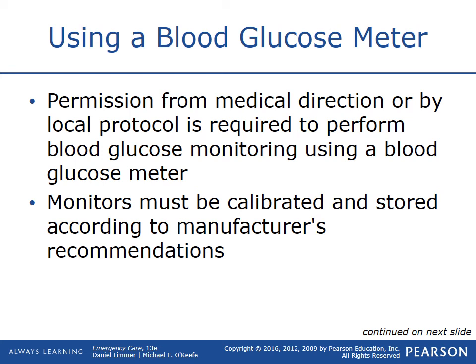I have personally seen glucometers be bad that'll give a patient a reading that says normal, but then if you check it with another one, it says that it's low. Sometimes they just need calibrated or cleaned, or just ultimately replaced.